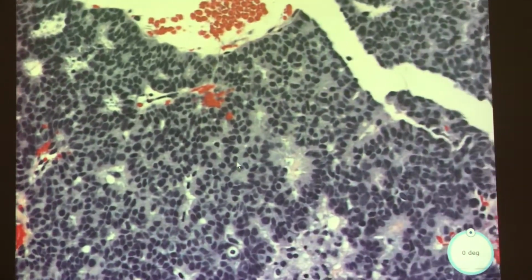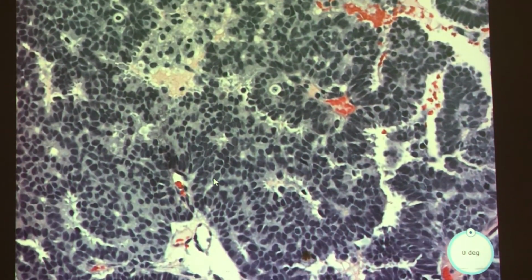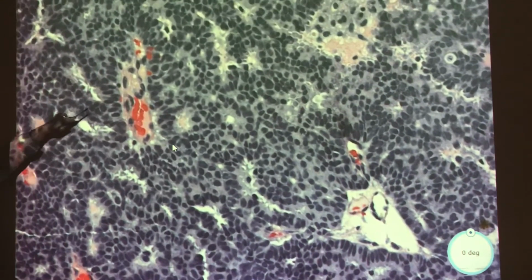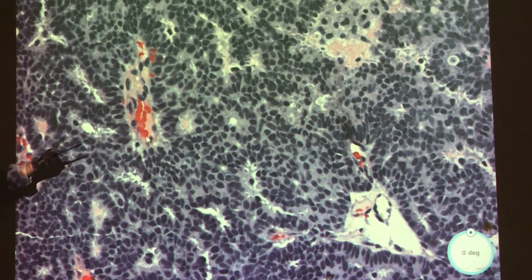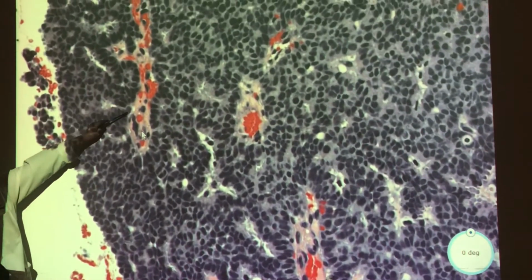Now, are these all potatoes? That's what I'm evaluating here, because I'm seeing some cells that kind of stand out. This one here? What's that? Which one? This one? Oh, this? That looks like a blood vessel. Blood vessel? Okay. Yeah. And if you keep going, there's another one. Mhm. There's another one.